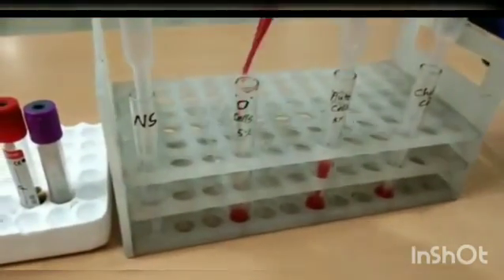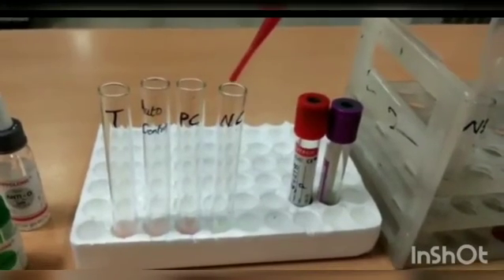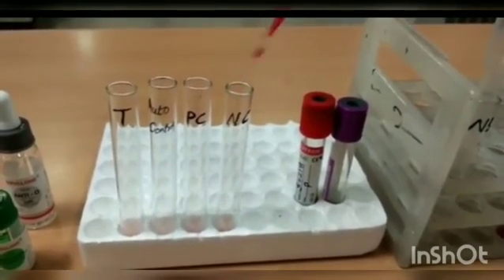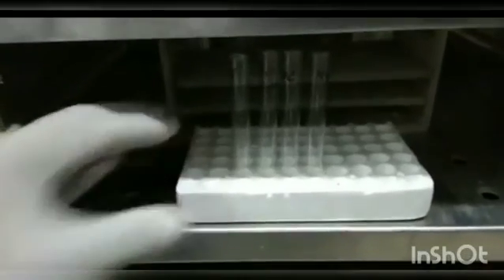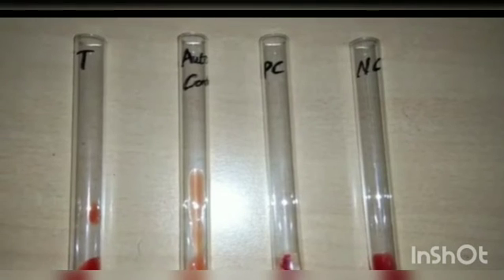And then add O cells to the positive control and negative control, and incubate it at 37 degrees Celsius for 30 minutes, and then look for agglutination.